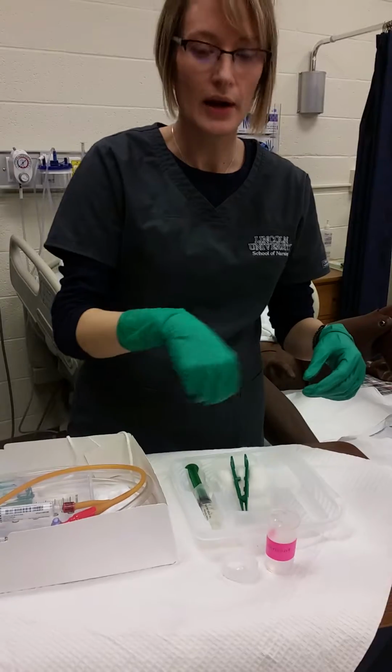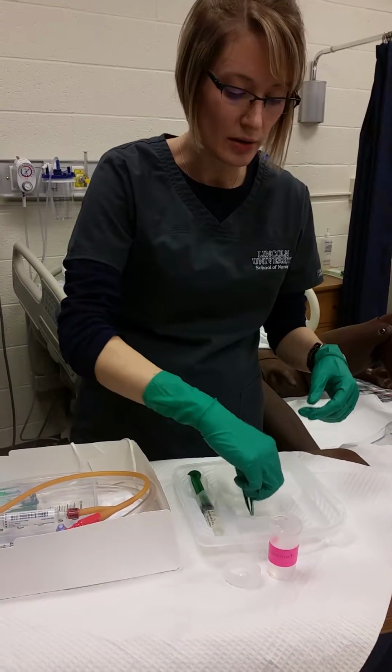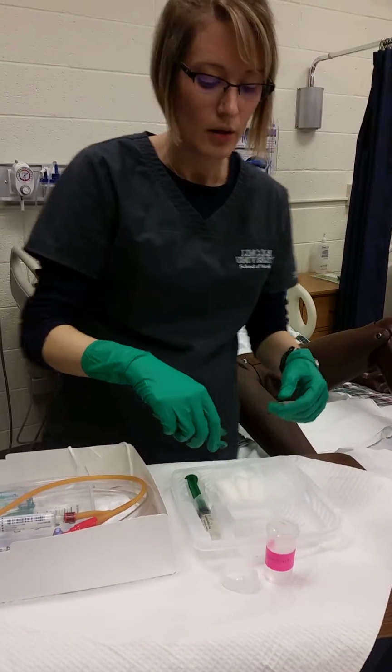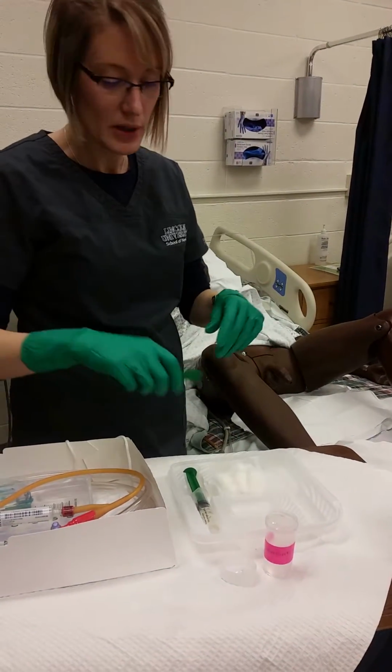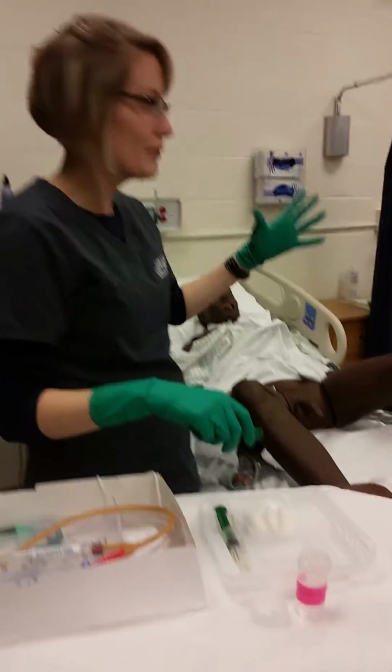And then there would be a package of iodine in here that I would use to saturate the cotton balls that are in the kit. We're just going to pretend for this. Once everything on my table is ready, I'm going to contaminate my non-dominant hand.